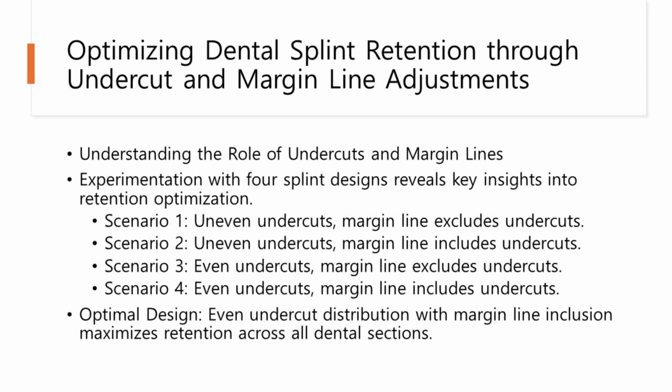Our approach involved creating 4 distinct splint designs, each varying in the distribution of undercuts and the inclusion or exclusion of these undercuts by the margin line. This methodical approach allowed us to evaluate how these factors influence retention in vital dental areas.